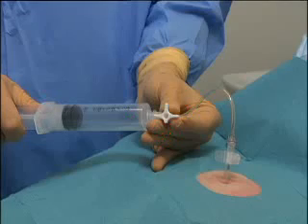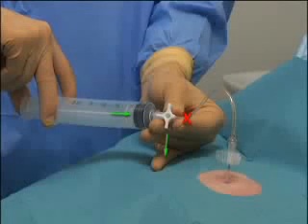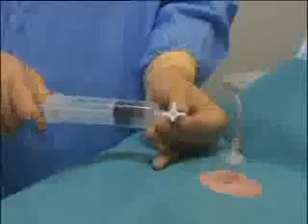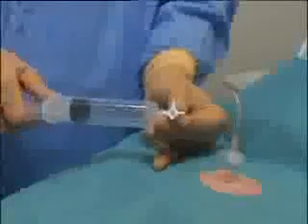To evacuate the air into the ambient air, you must turn the stopcock so that the syringe is connected with the environment, but not with the patient. Make sure that the pleural space is never connected with the environment while you are turning the stopcock. Measure the volume of the air that is aspirated by counting the number of syringes evacuated.